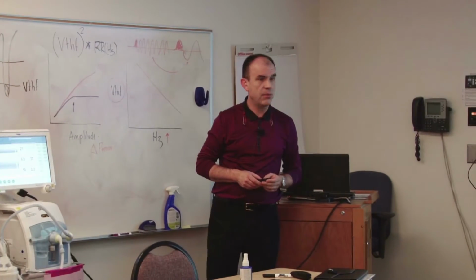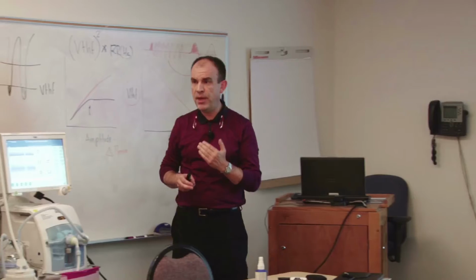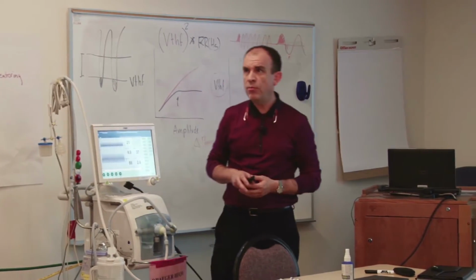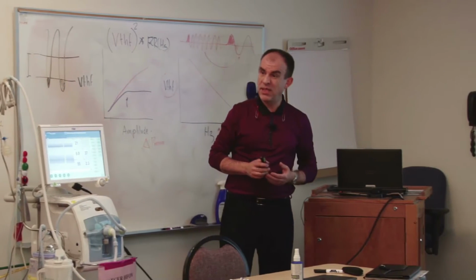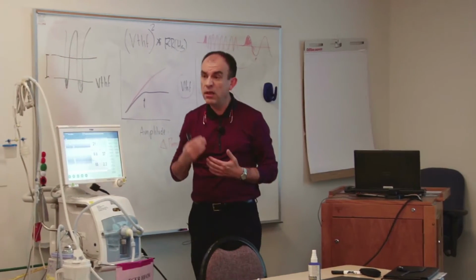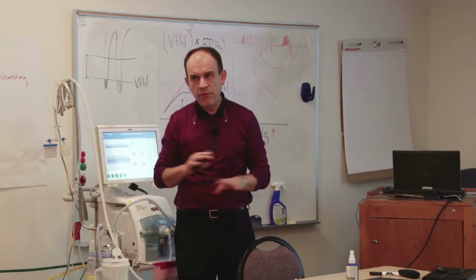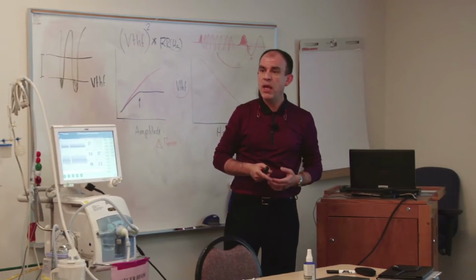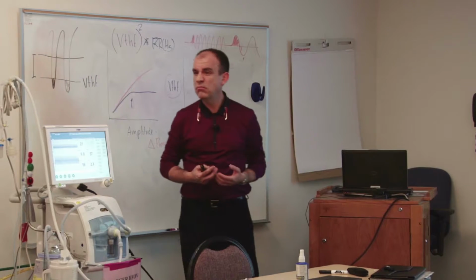We have gone to 6 sometimes, but mostly in bigger babies. But we've also done, mostly with premature infants, we begin at 10. Some people begin a little bit higher, 11, never above 12, because of the reason I just showed. And we can go as low as 8 sometimes.